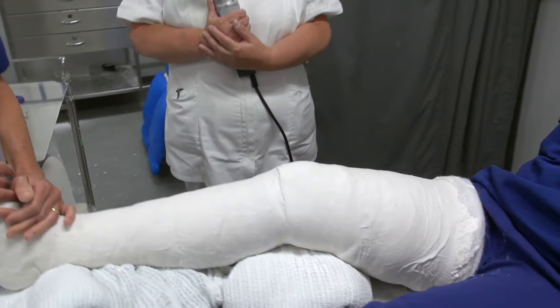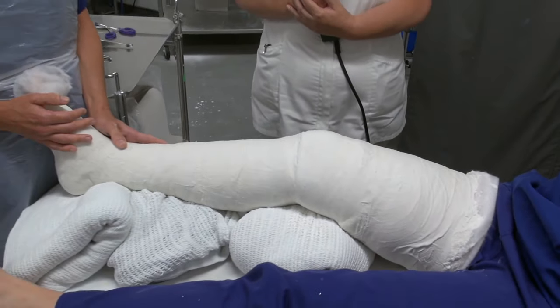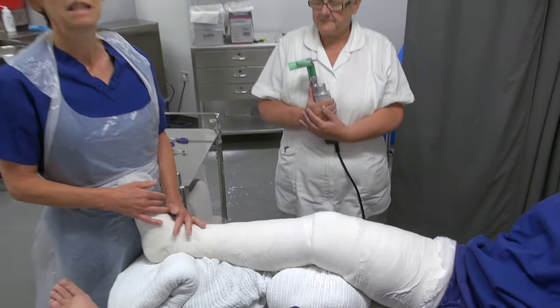So Pam's going to go ahead now and show how we're going to split this cast. It's a little bit noisy at times and creates a little bit of dust as well, so you need to be in a nicely ventilated room.